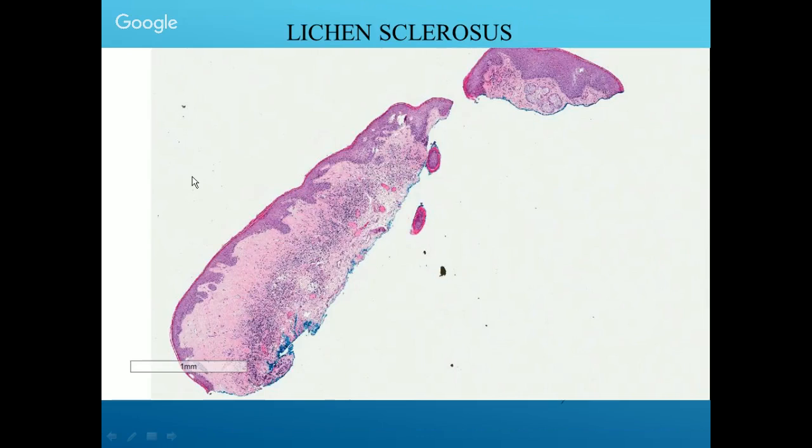This is very characteristic, has the lichenoid infiltrate, but in this condition, what happens if the lesion is biopsied? Initially, the inflammation is at the dermal epidermal junction, but as the lesion progresses, you develop this sclerosis in the papillary dermis, and the inflammation starts getting pushed below the sclerosis actually. So if the lesion is biopsied after a certain period, the patient has not done anything about it, then the inflammation doesn't hug the dermal epidermal junction but is below the sclerosis actually.